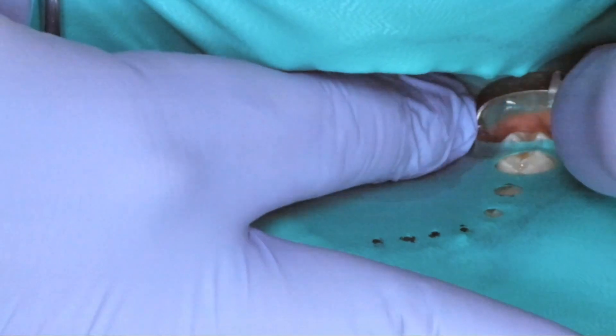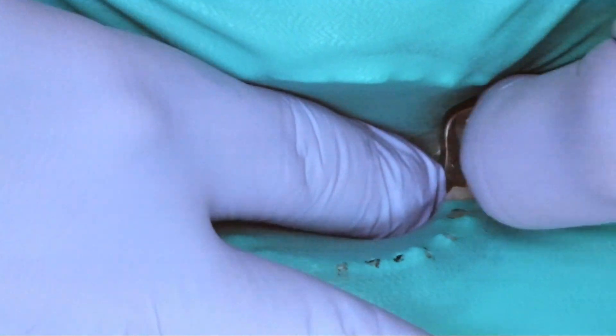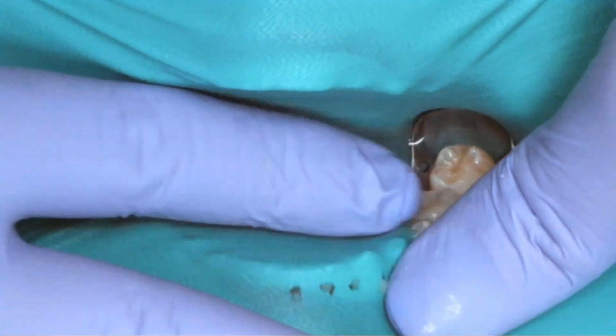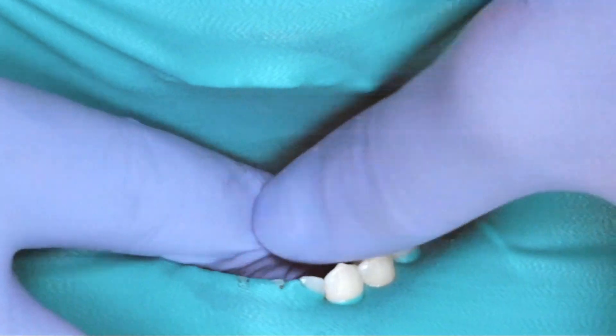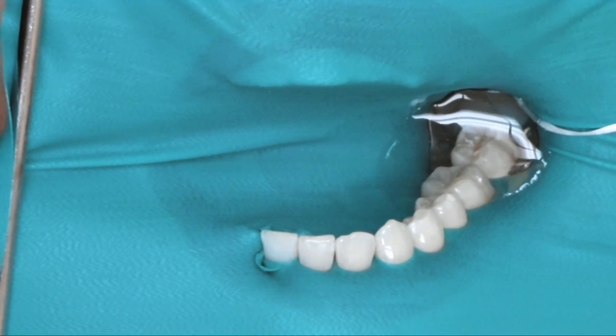My last setup involves the lower posterior quadrant and it follows the same exact protocol as the upper posteriors. However, I use a different clamp which I find fits comfortably over most molars. As you can see, the rubber dam fits snugly on each tooth and has no leakage whatsoever.